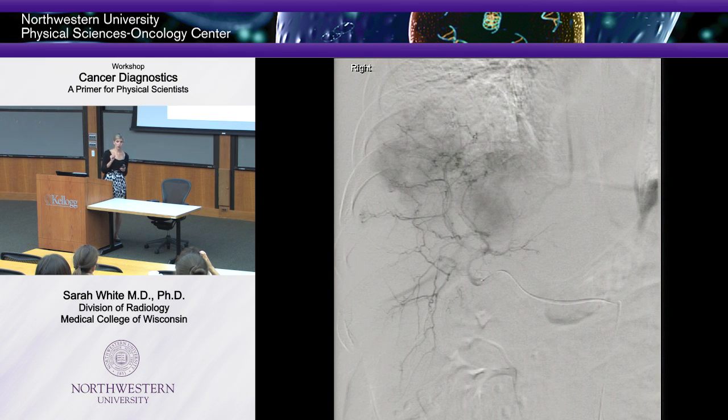Okay, I injected chemotherapy directly into those tumors. And I actually mix my chemotherapy with oil. We knew back in the 80s, actually way before that, I think 1906 was the first time they used oil. And that actually, the tumors take up that oil and it stays in the tumor, it retains it. So one, we can see that the drug got there, but also we can see if the tumors take up that oil, it means they will have a better response to therapy.